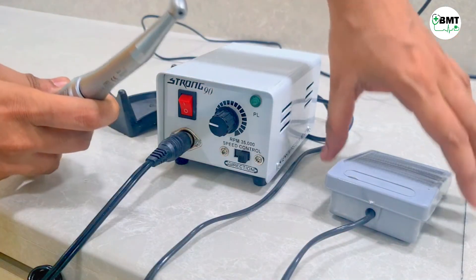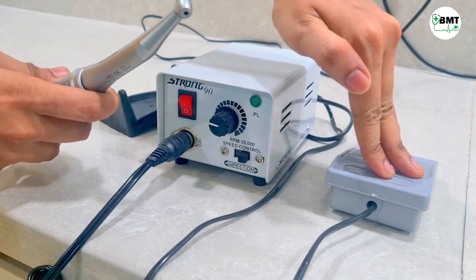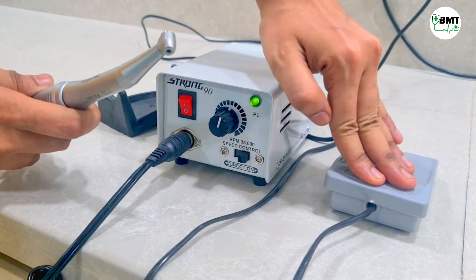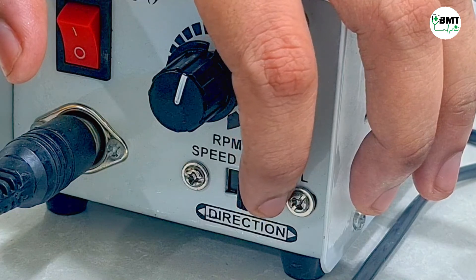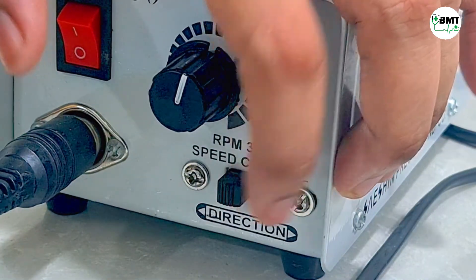To operate in the other mode — through the foot switch — you press the foot switch and only then will the motor operate. You can increase the speed using this control. In this way, speed is increased. You can also change the direction of drilling, which may be clockwise or anticlockwise, and you can change it from this switch.